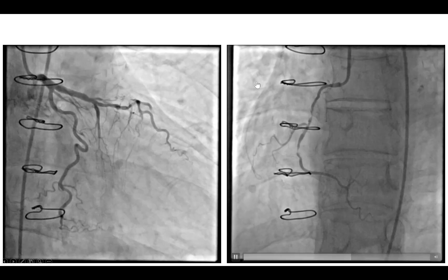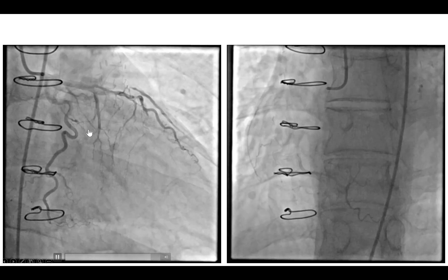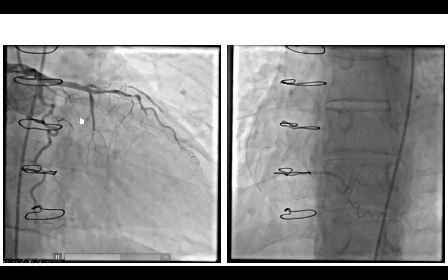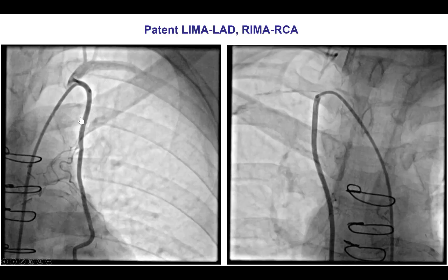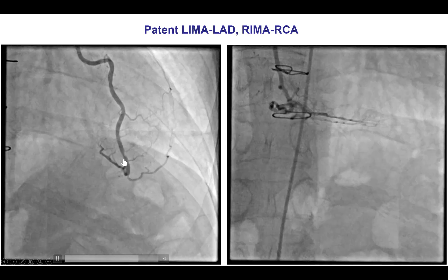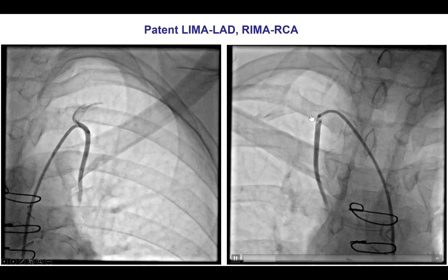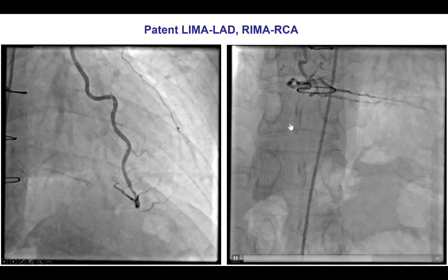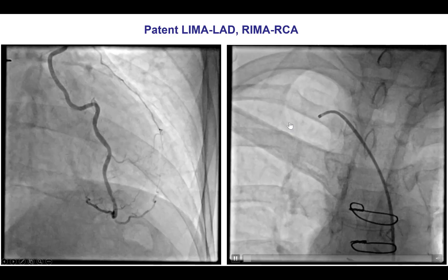Diagnostic angiography showed occlusion of the LAD, the obtuse marginal, and RAMUS branch. There was also occlusion of the right coronary artery. However, both the LIMA to LAD and the RIMA to the right coronary artery were both patent without significant lesions.